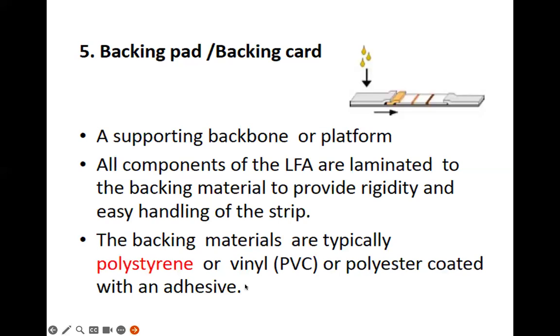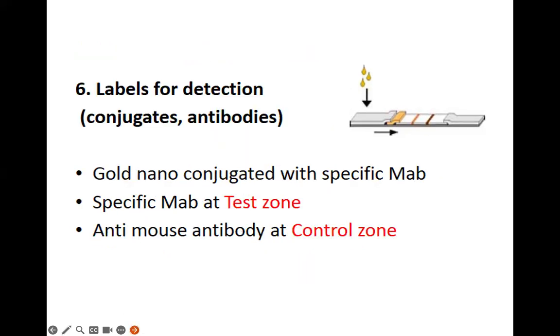And the backing pad is actually just a support where you put all the padding, the conjugate pad, the sample pad, test line pad on top of the support. Okay. All right.